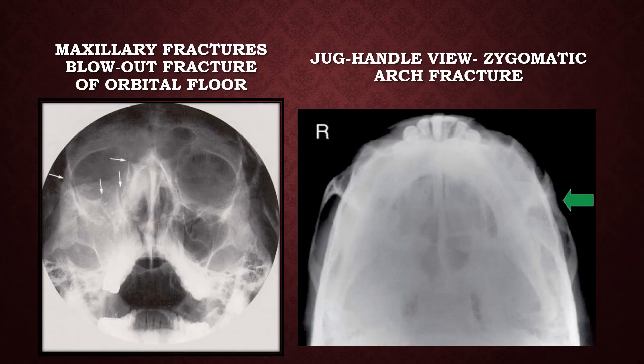Maxillary fractures — this is an example of a blowout fracture of the orbital floor, where you can see multiple areas of fracture at the floor. This is a jug handle view, also called the submentovertex view, showing a zygomatic arch fracture compared to the normal right side. The left side shows the fracture.